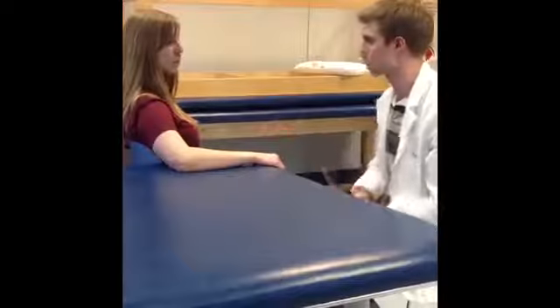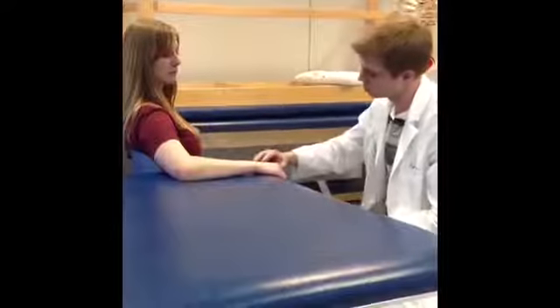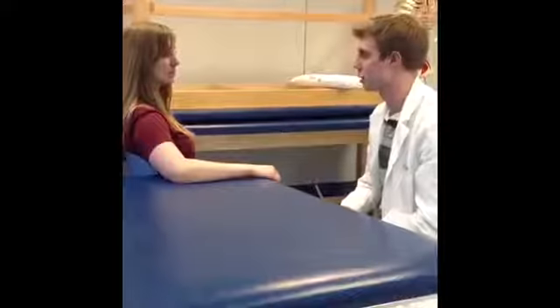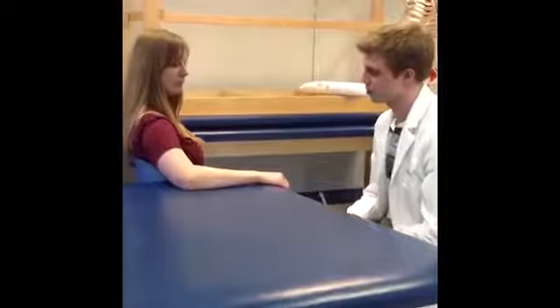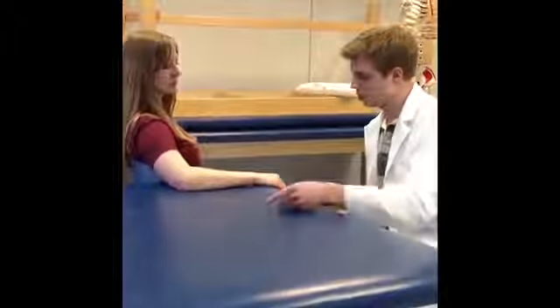So you want to instruct them that you might have a little pressure pain here, a little stretching in front, but there shouldn't be any exaggerated pain, nothing that's going to make you too uncomfortable. Okay? So now we're going to go on to the actual measurement.